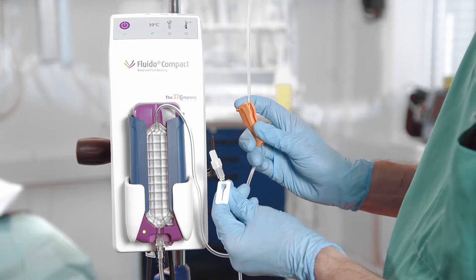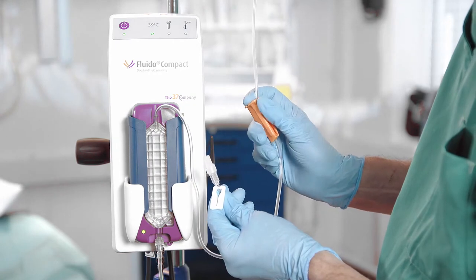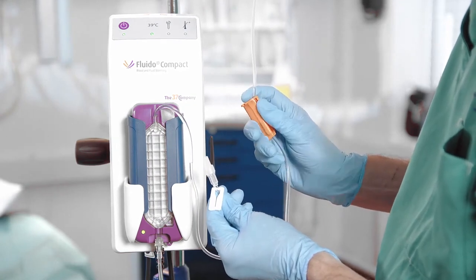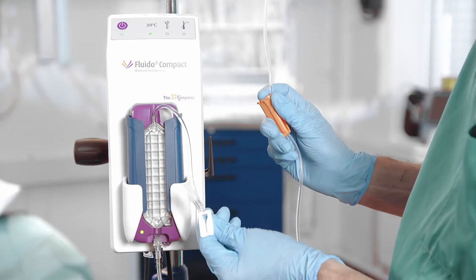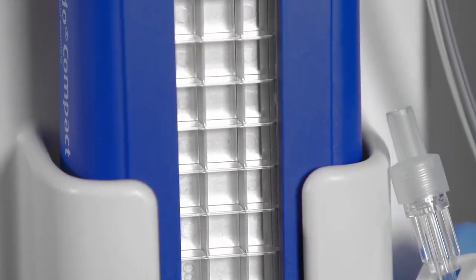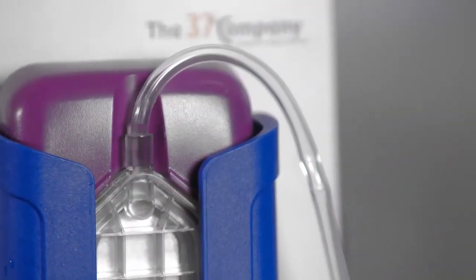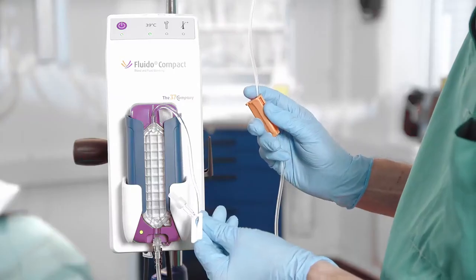Keep the standard set in the upright position during priming. Make sure that the slide clamp of the standard set is open, and open the roller clamp of the hospital administration set to prime the complete system. Make sure that there is no air left in the system and close the roller clamp.